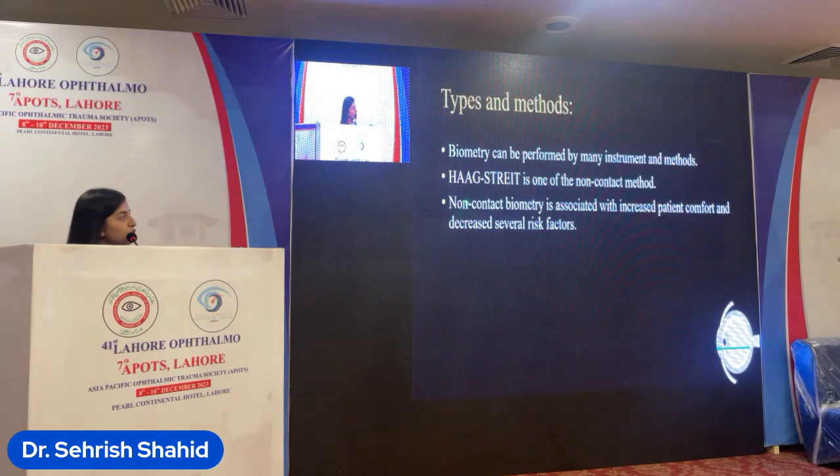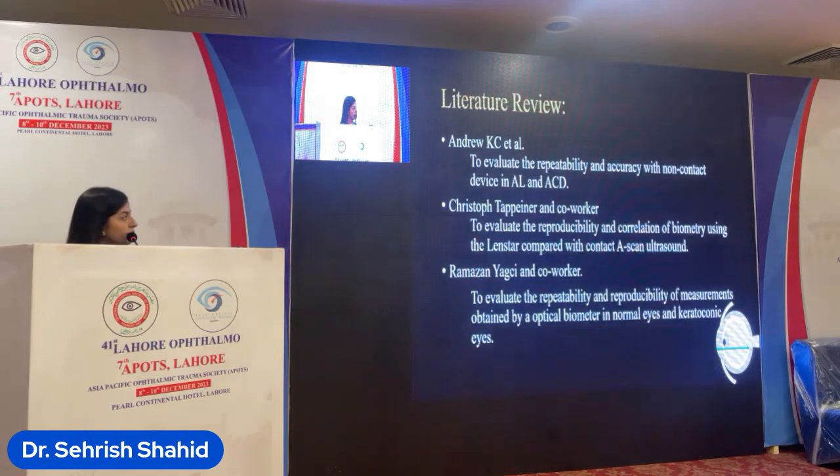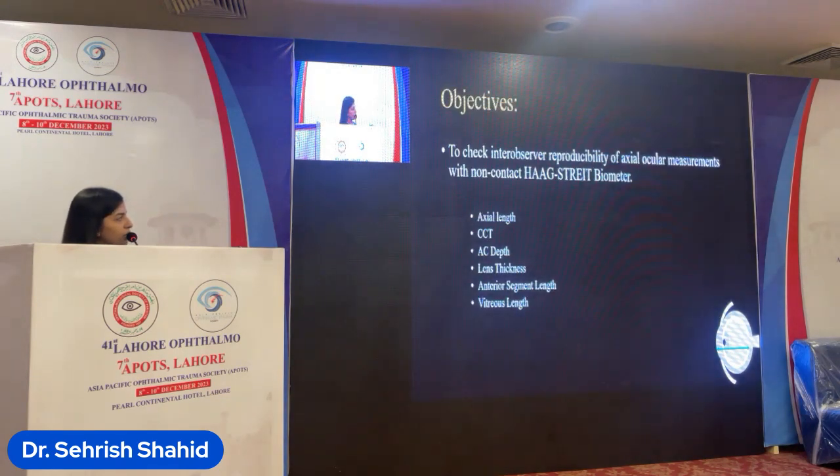There are several ways to perform biometry, including contact methods and non-contact methods, and obviously the non-contact methods are better because of patient comfort and decreased risk factors. Here I have discussed a few of the studies that have been done previously. Andrea concluded on the repeatability of a non-contact biometer for axial length and anterior chamber depth, and there are also two studies already done on different parameters of the eye.